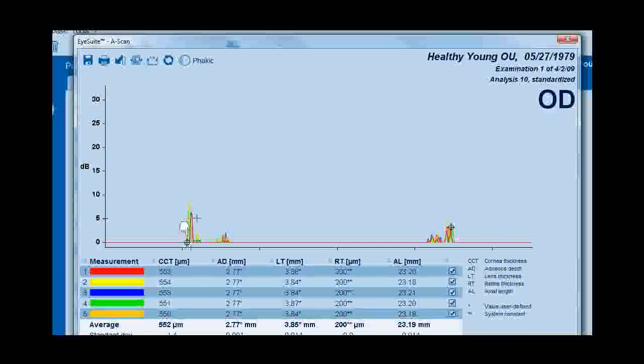To adjust the posterior lens gate, place the mouse cursor over the posterior lens gate. This will give the mouse cursor the four-direction arrow appearance. Left-click and hold to move the gate to the preferred location. Letting go of the mouse button will reposition the gate.